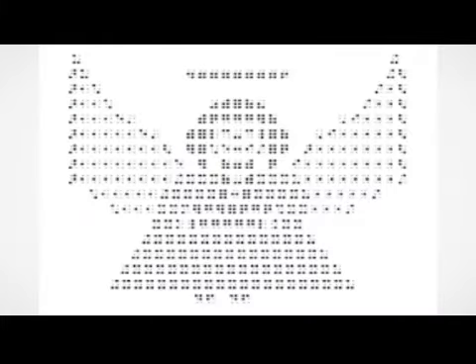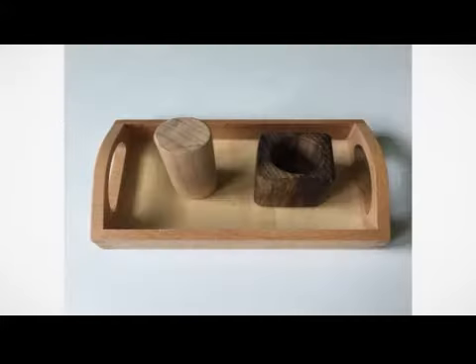Peg slate is a paperless device designed to help teach beginning users of Braille slate. A frame is mounted with pegs that represent the Braille dots in 10 Braille cells. A finger is used to push the pegs down. The frame is then flipped over to read the Braille message.